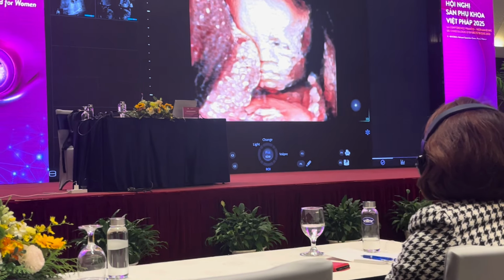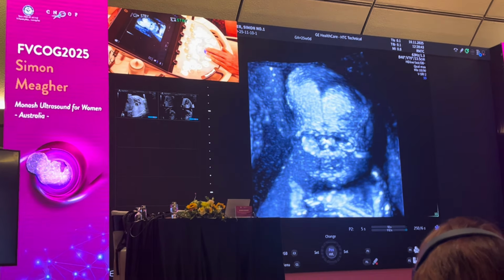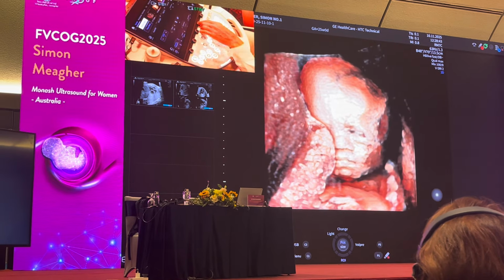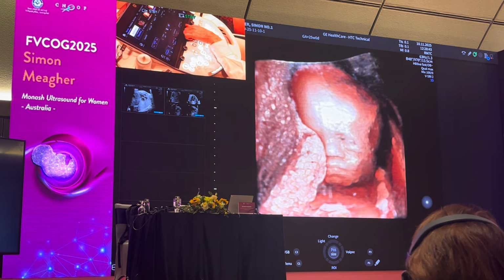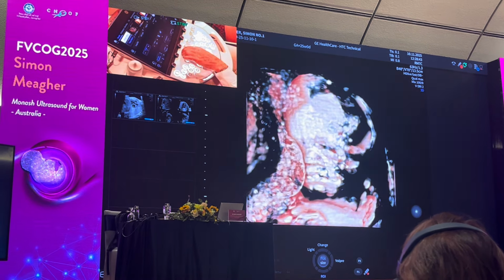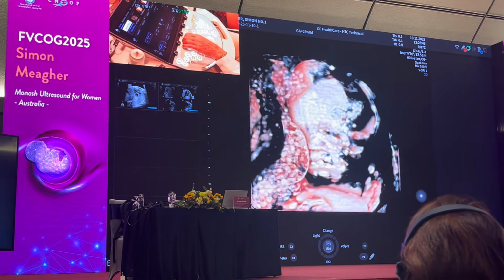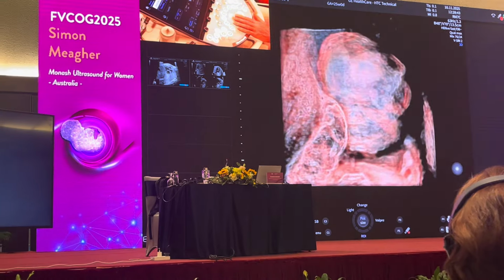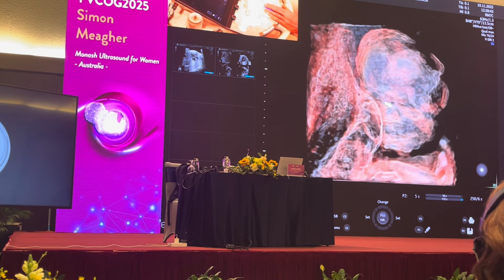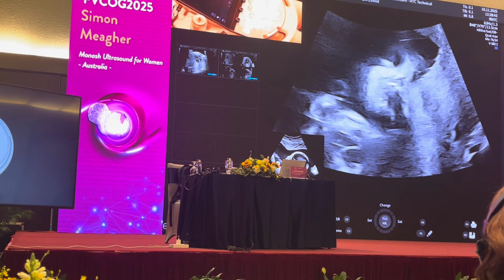So on this section of the HD skeleton, you can look first of all at the nasal bone, which is present on the right and left side, as an option. The other option you can look at is this one. You can put back the gain, might have the echoes, and then increase your silhouette. As you come across here, you can see your nasal bone in that rendered image. So these are the options in terms of looking at the baby. Another one here, the shape of the bone on the left and on the right hand side. We'll save that image for the mother.